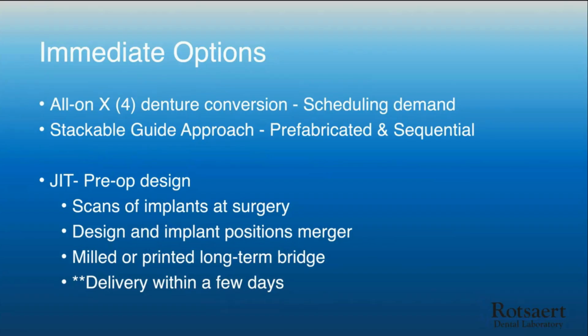The other thing to keep in mind is when you're doing just in time, this is one we actually see the most. And this is what I really like. So the surgery is done on a Friday or any day of the week, the surgery is done in the morning. We get the scans in, but of course we've pre-done the case. We've designed it all in advance. We've done a smile design. We know what the end is in mind. The scans of the implants are done at the time of surgery. So right then and there, they're sent to us. And then all we do is merge everything that we've already pre-done with now the fit of the implants.